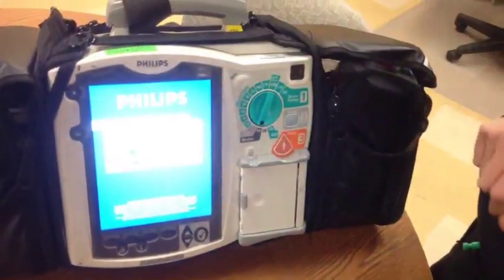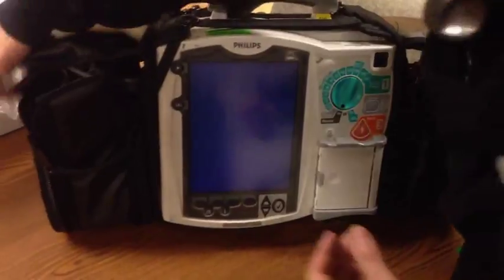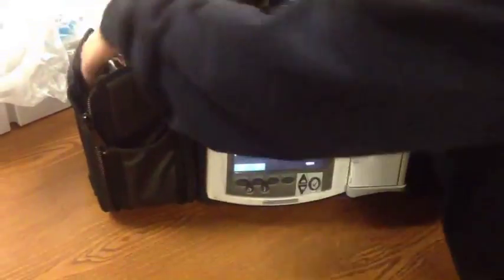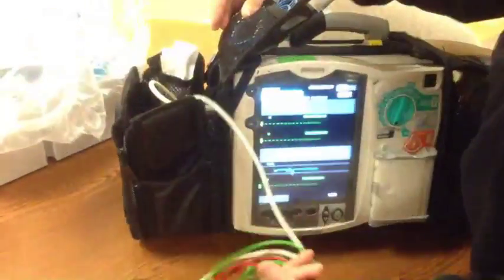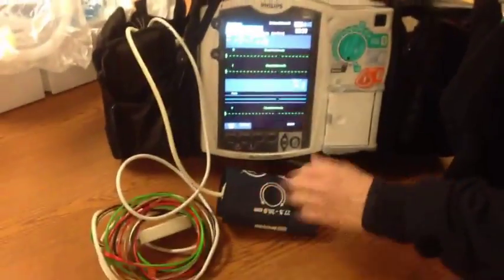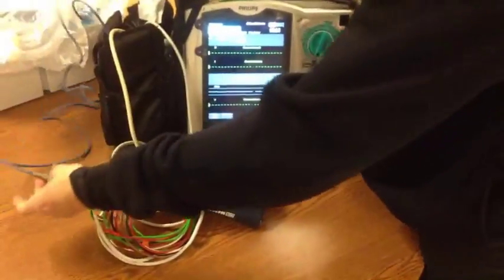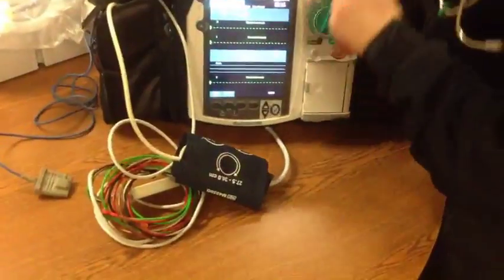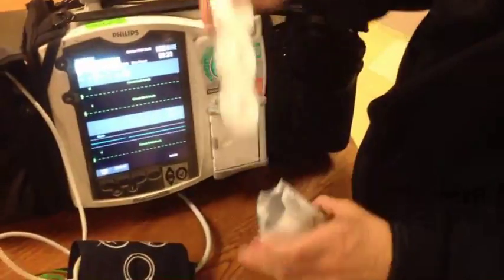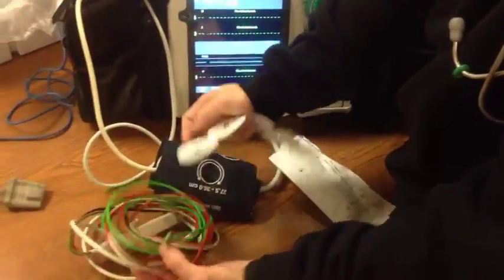We will turn our selector knob to on, and the screen comes up. In the side pocket here, you have all the cables needed for EKG monitoring, non-invasive blood pressure monitoring, as well as pulse oximetry. In the back part of the monitor, there are packages of electrodes. You would simply open up the electrodes and then attach each one to a lead.